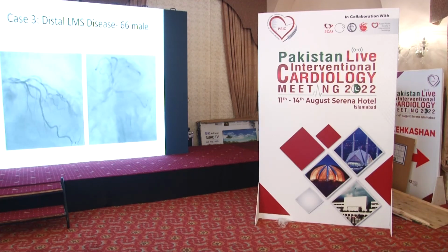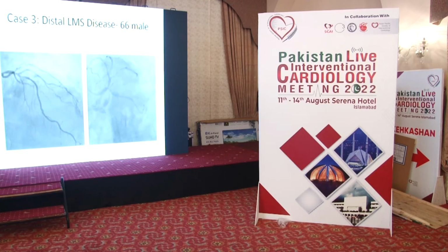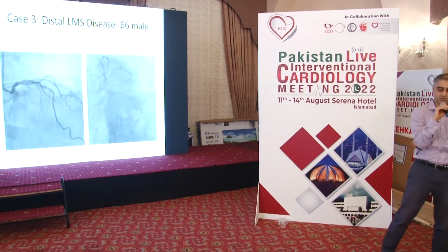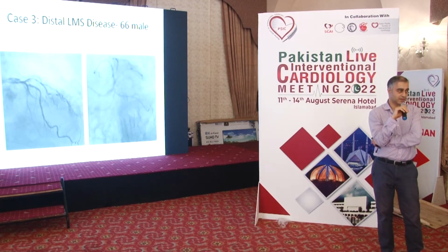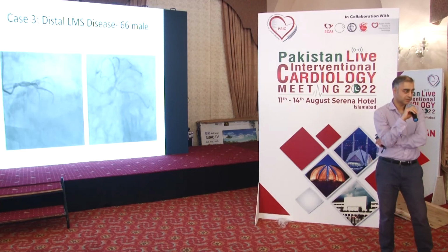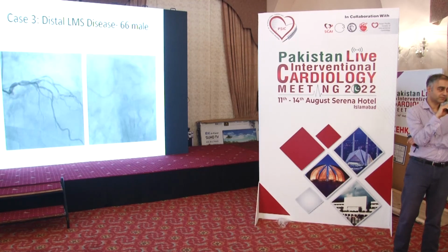So, you can image this, but you can do physiological assessments as well, couldn't you? Yeah, so you've got a couple of options in terms of what you might want to do. So, anyone with a borderline left main stem stenosis, I tend to reach straight for the IVUS catheter or perform FFR. Next slide.